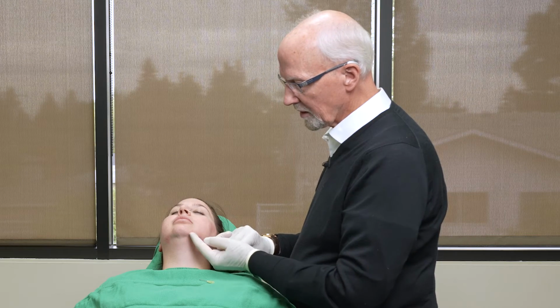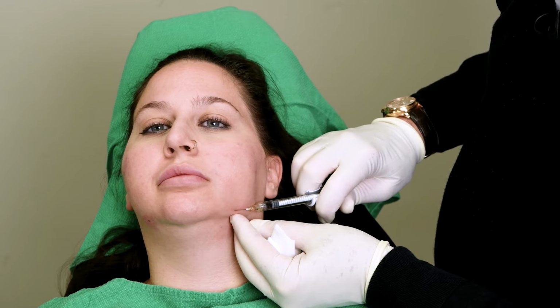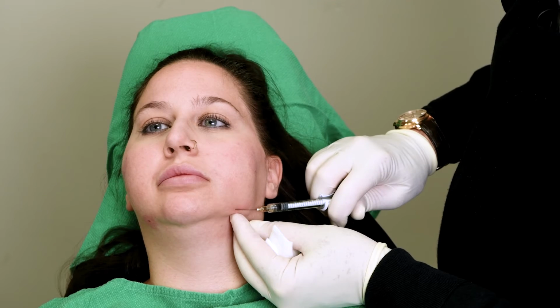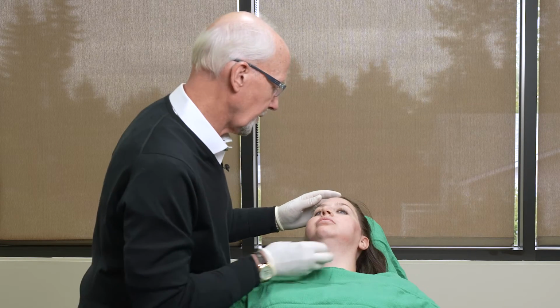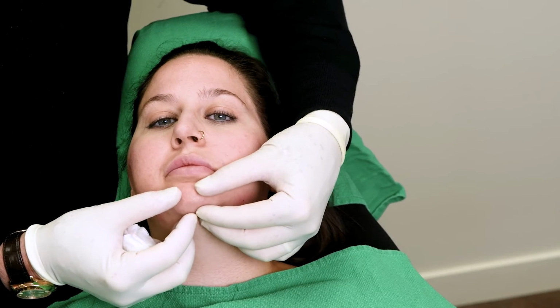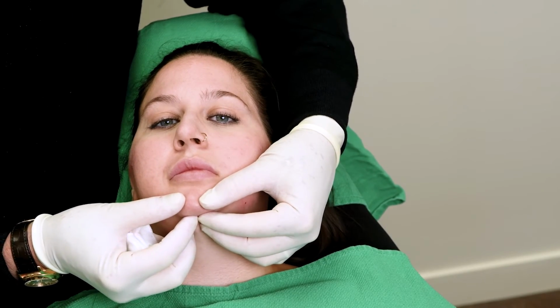Okay, so we can start to see product coming up here. And so in this, we're going to put in 0.5 cc's on each side. So we can see how this has come up on this side as well. I'm now going to add a little bit of product to her chin just to bring this down as we look at straightening out the jawline.